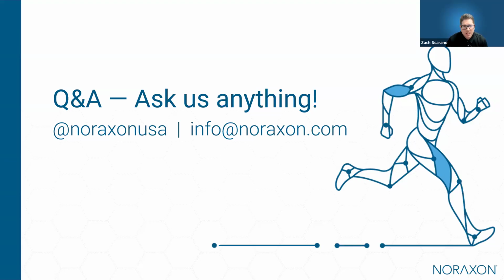EMG validity studies. Yeah, there's several. We've been producing EMG technology for almost 40 years now. So we're pioneers of low noise electromyography devices, as well as telemetry devices and wireless devices as the technology has been advanced over the years. So our systems have been used in hundreds of research studies over that time, maybe even more, maybe on the order of 1,000 at this point. But yeah, I would just encourage you to go look on Google Scholar and search for Noraxon EMG.